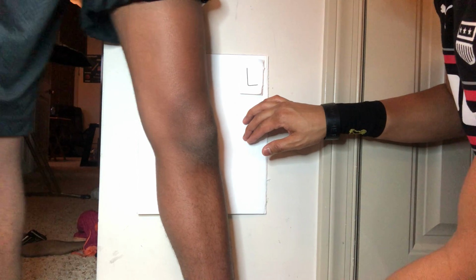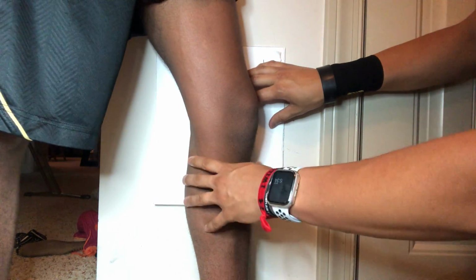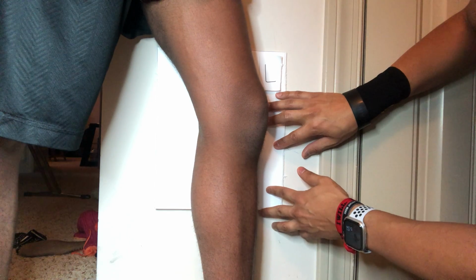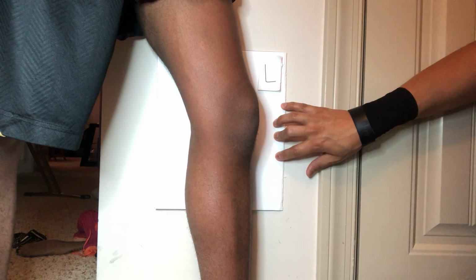Next is going to be the lateral knee. In this case, we're going to have the patient laterally turn the knee here. The knee is going to be flexed at about 20 to 30 degrees. Again, it's 40 SID on a 10 by 12 image receptor, with the left marker here to indicate it's the left knee that is affected.